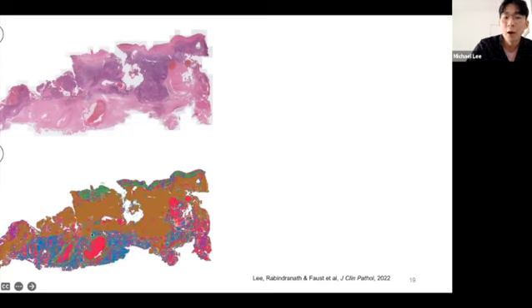And essentially the brown area represents the tumor, whereas the red is blood, blue is the necrosis, etc. So there are different classes within the tissue. But we want to focus on the brown region because that's where a lot of the IHC stains would stain specifically, rather than normal tissue or the necrosis, which don't have cells, and red blood cells, which we aren't interested in.